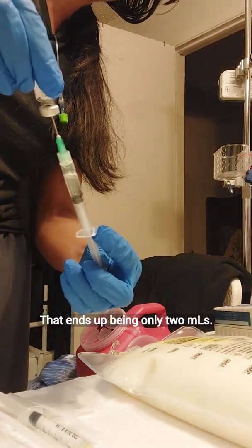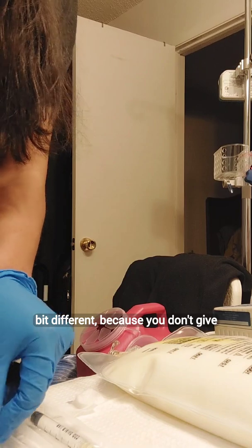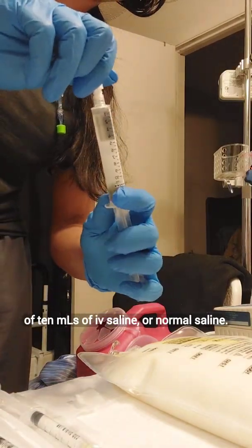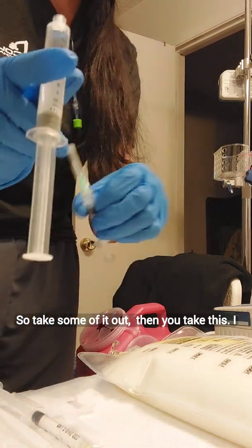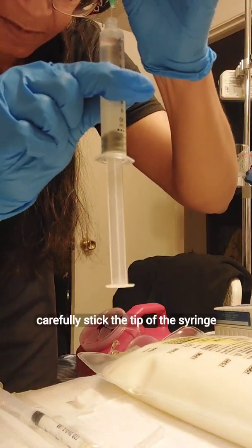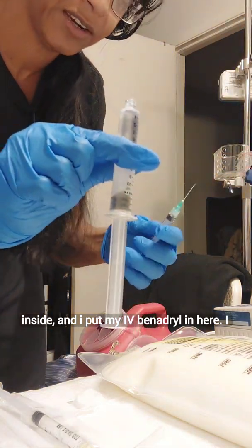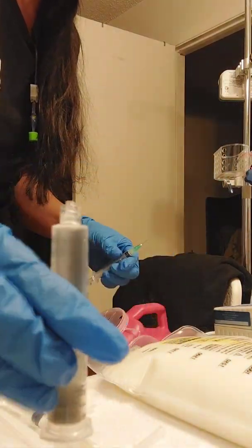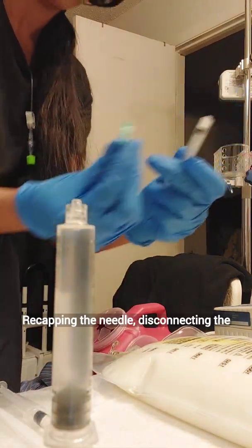That ends up being only 2 ml. Now what I do with the Benadryl is a little different because you don't give straight Benadryl. So I have a syringe full of 10 ml of IV saline — normal saline — take some of it out, then take this, uncap it, carefully stick the tip of the syringe inside, and put my IV Benadryl in here. I'll invert it a couple of times just to make sure it's mixed properly. Then I recap the needle and disconnect the two.